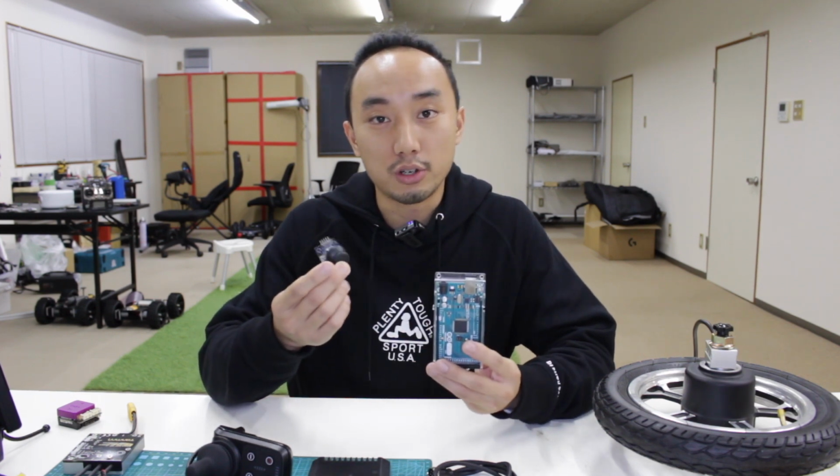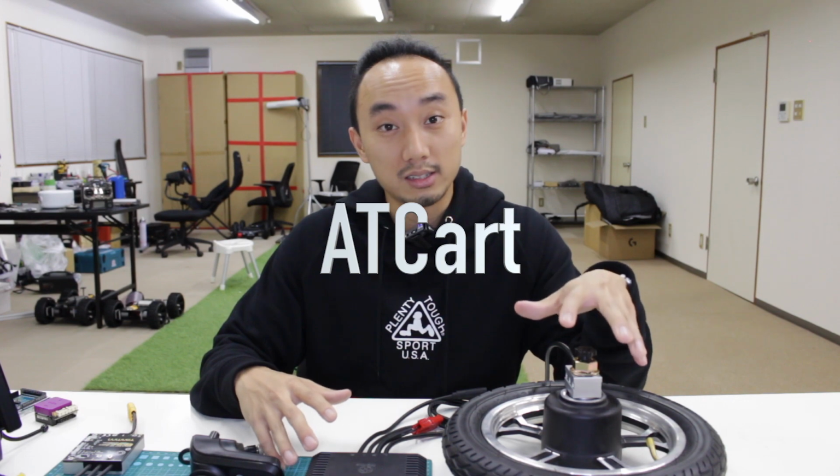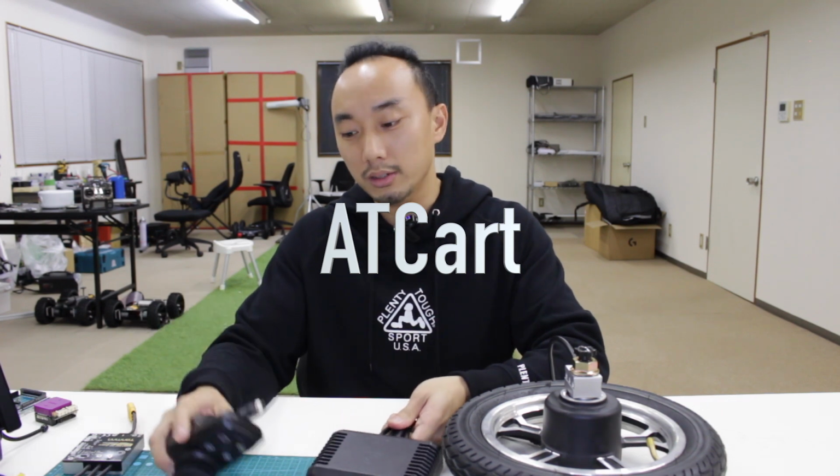So if you have the Arduinos and this kind of joystick, you can upload my codes and try to play it by yourself if you have a similar wheelchair controller like this. From that hacking solution, we decided to call it something else instead of saying wheelchair every time. It's not that cool for the robot. So we call it the ATCart. It consists of the wheels and this black ESC, and the joystick is an option.